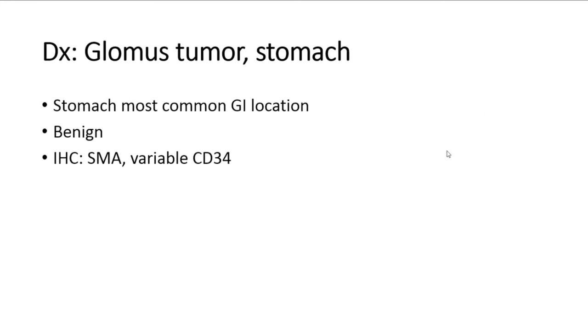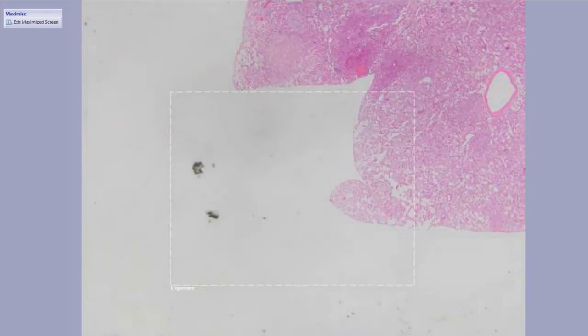Sticking around in the stomach, case, trying to do the, well, you got spoiled. That's what I get for trying to control the keyboard with my left hand while I do the microscope with my right. But anyway, pretend you didn't see the answer.